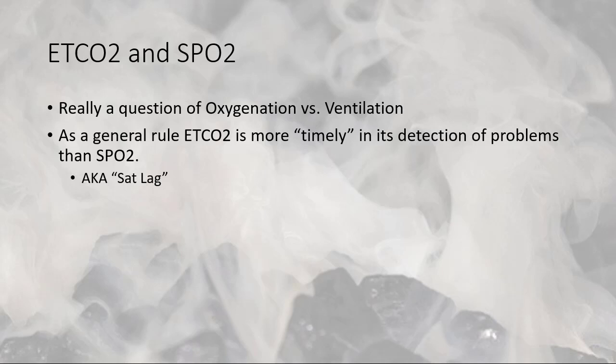Whereas we talked about SPO2 is often delayed by 60 to 120 or even 240 seconds, what we call saturation lag. Because SPO2 measures in an extremity what's going on in central circulation, and End-Tidal CO2 is an indirect measurement directly of central circulation because of pulmonary perfusion.